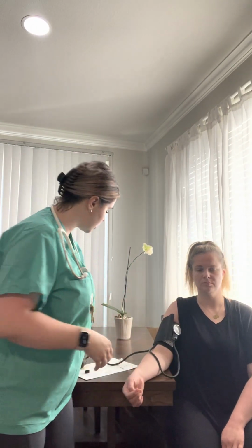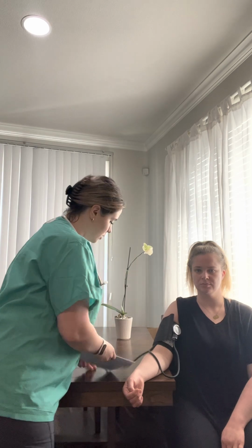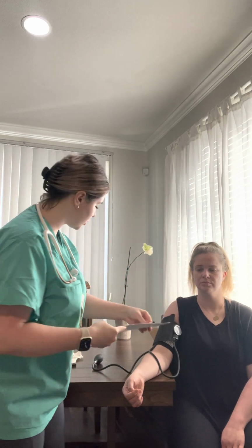Our patient's blood pressure was 120/80, so we're going to go ahead and document that. Our patient's typical blood pressure is 122/80, so her blood pressure is within normal range.